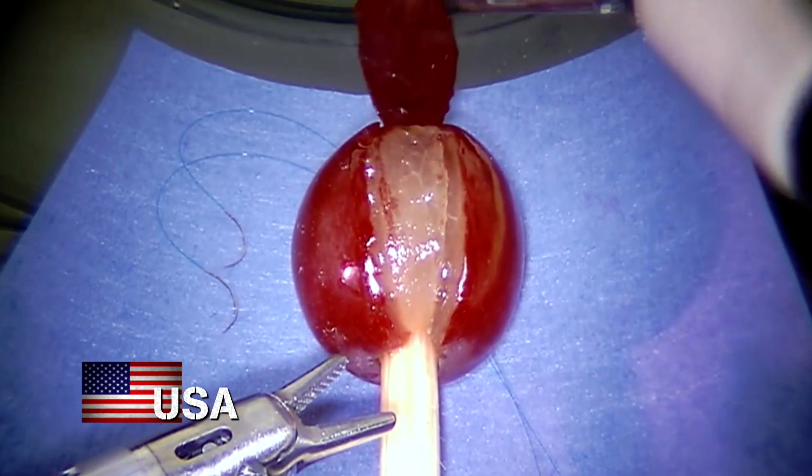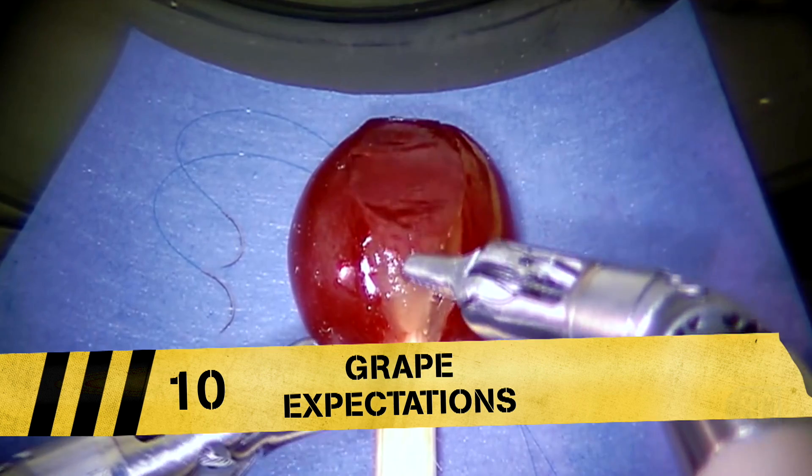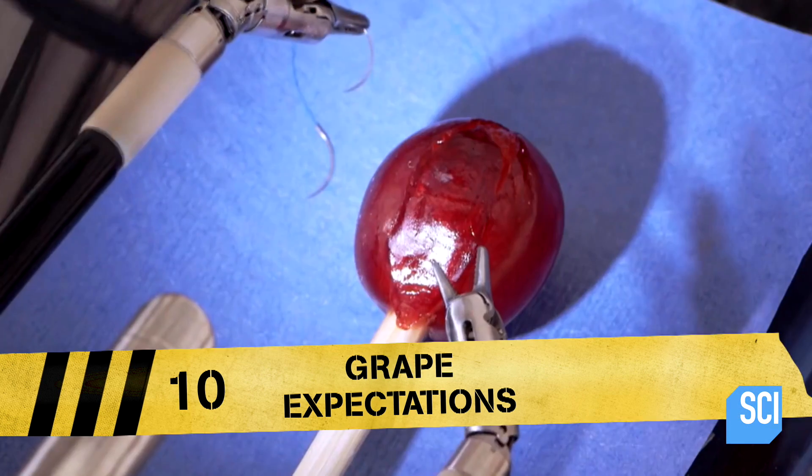This is the awesome DaVinci Surgical System, performing open fruit surgery. Stitching up a grape? Wow!